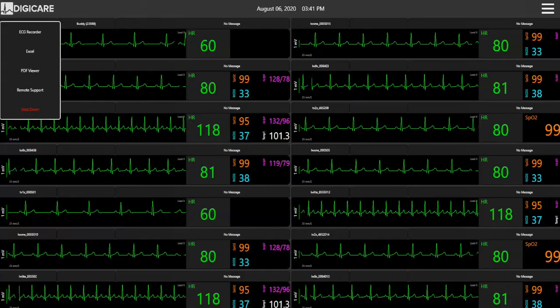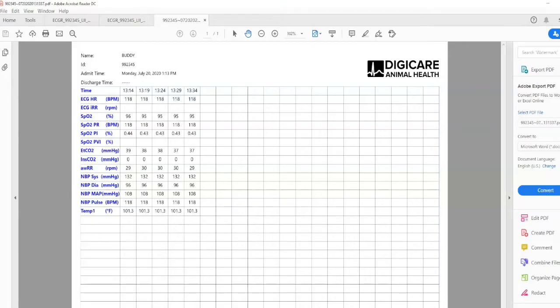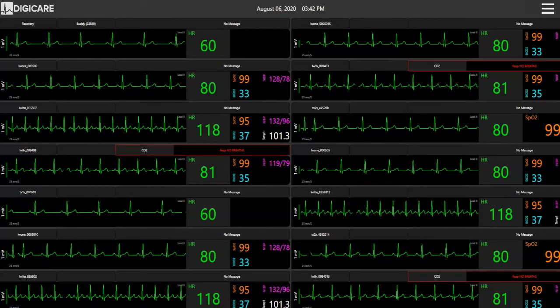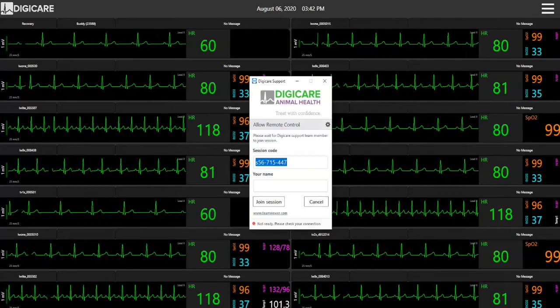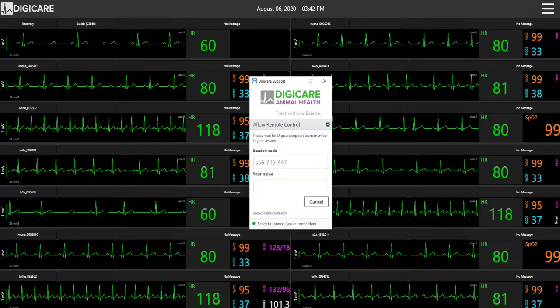Tabular data can be saved in an Excel format. You can also save the tabular reports as a PDF. Customer support and satisfaction are a top priority at DigiCare Animal Health.